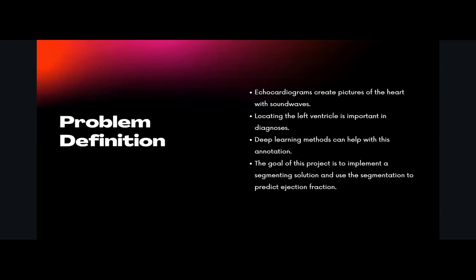And the goal of this project is to implement a segmenting problem and then use that segmentation to predict the volume of the left ventricle, which can then predict the percentage of blood leaving the heart each time it contracts, which can diagnose certain heart failure.